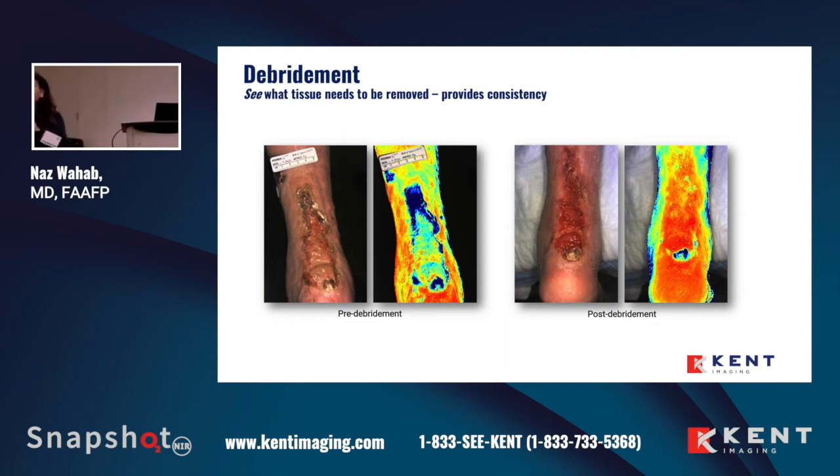Post-debridement, it can really guide you to continue to debride. How much do you need to debride? And where do you need to debride? That could really institute greater blood flow. It's very, very important, and you can see it as a very obvious pictorial.